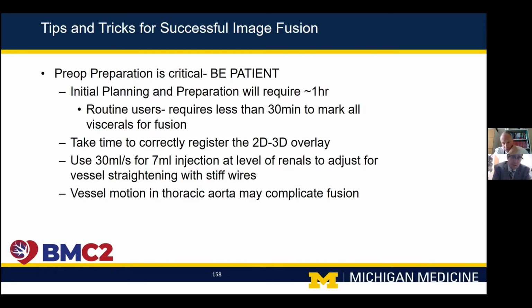But when I do it now, routinely creating both those segmented images and then the markers usually takes me less than 30 minutes. Once you've done that, with the patient on the table, you want to make sure to register the overlay on the patient. It's a couple of minutes, but in the end, I would argue that those couple of minutes are going to save you much more on the other end of it.